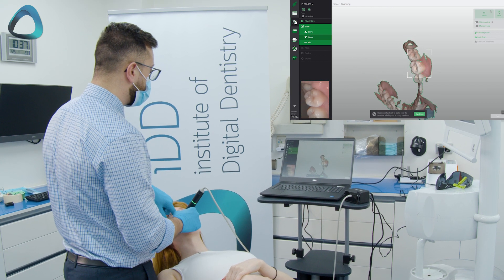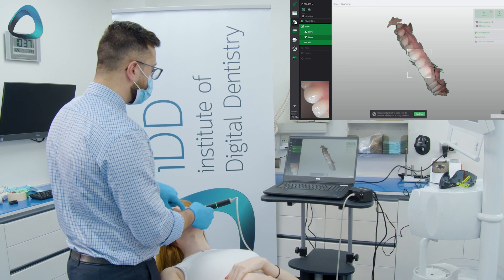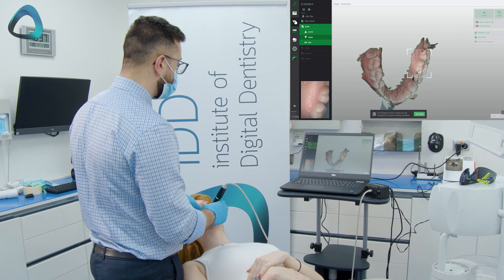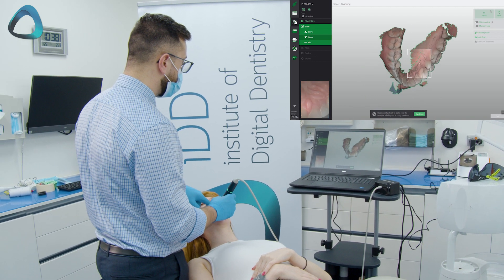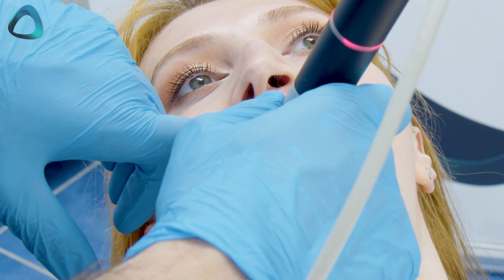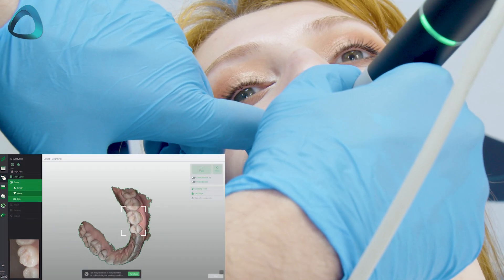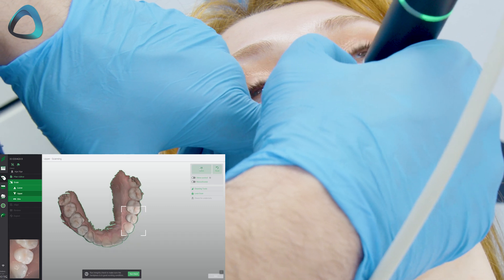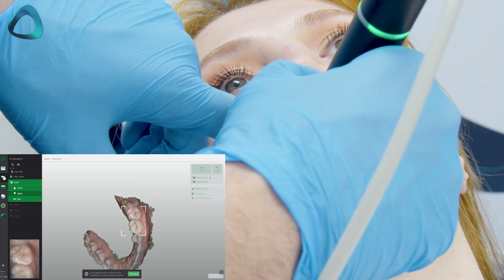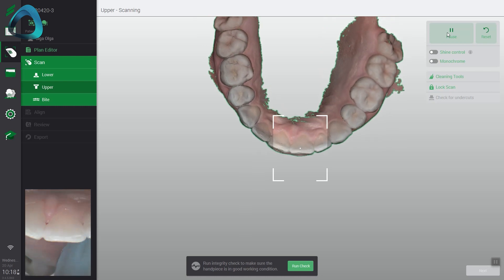One interesting thing to note about the Virtuo Vivo is that the focal distance of the scanner is very close to the teeth, so you are holding the scanner right up against the tooth surfaces. The company also recommends a rock-and-roll type scanning strategy, which means while scanning the occlusal surface you are constantly tilting and turning to get all three sides of the tooth. This is what the company refers to as rocking and rolling while scanning — the prescribed scanning strategy when using the Virtuo Vivo.